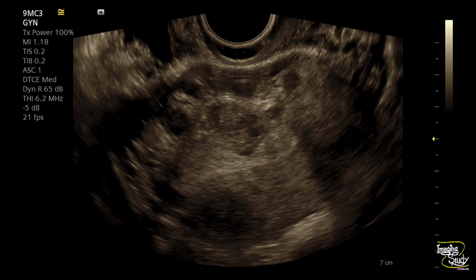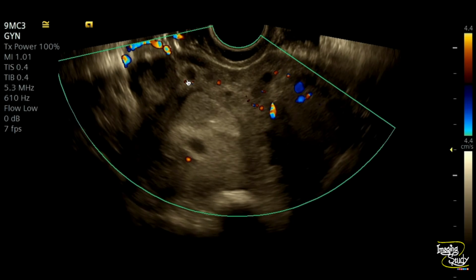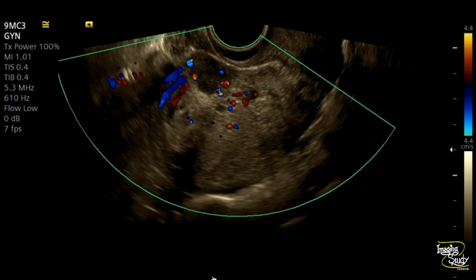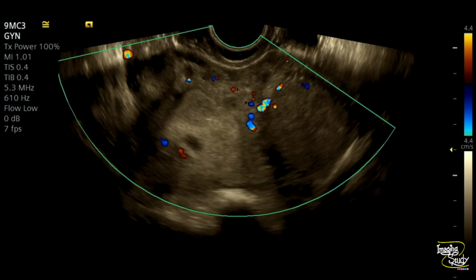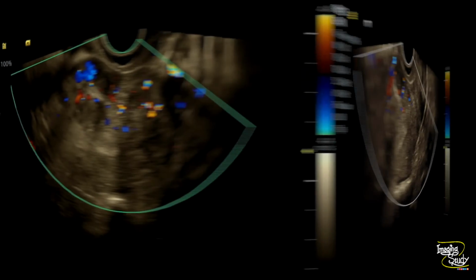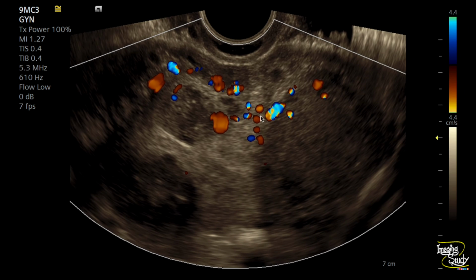Now let's put some color Doppler here. On color Doppler, you can easily understand that these prominent myometrial vessels are supplying each and every fibroid. So they're very prominent here. You know, I have some bad habits, like when I see vessels supplying any pathological structure, then I want to take a sample from that vessel. So here's the peripheral supply of the fibroids, and the picture with the vessel supplying the fibroid. Let's take some samples from these pictures.